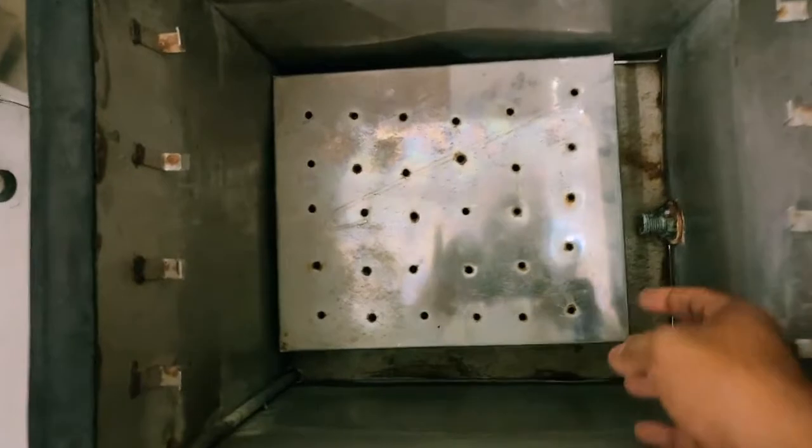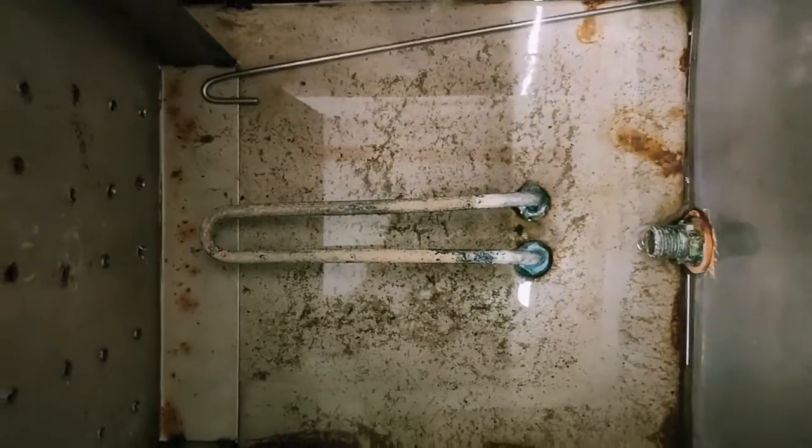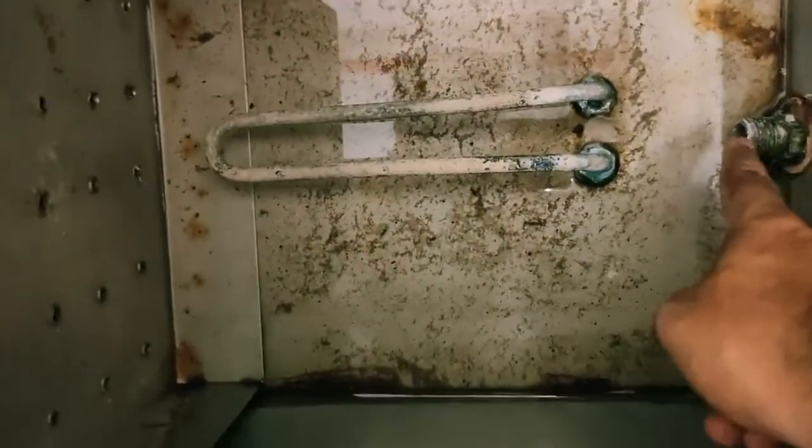Below this you can see there is a coil. With the help of this coil, the temperature of the water increases. There is also a tap so that whenever you want to change or remove the water, it can be drained out using this tap.